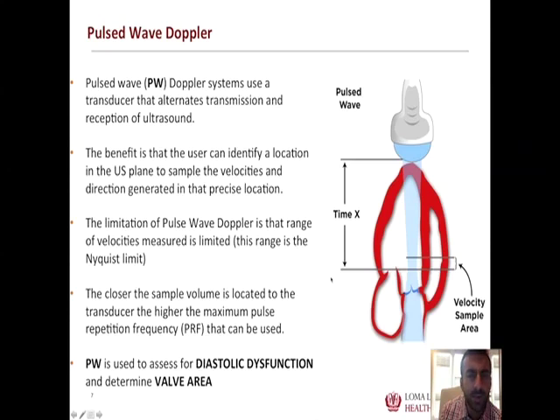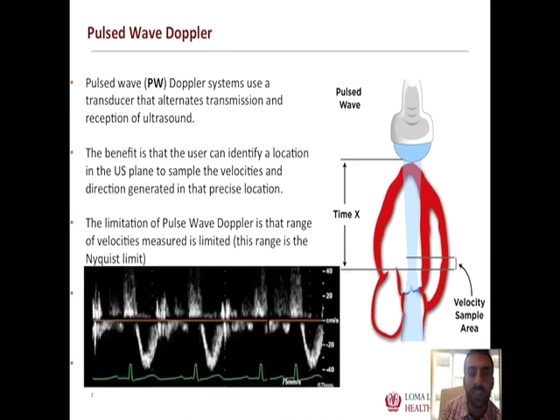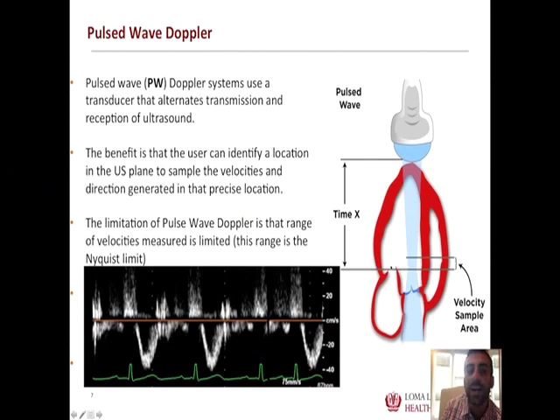Pulse wave Doppler is used for the evaluation of diastolic function by looking at a specific area of mitral inflow patterns, though those are more advanced topics. The pulse wave signal looks much more crisp simply because we're identifying an exact location where the velocity should be accessed.